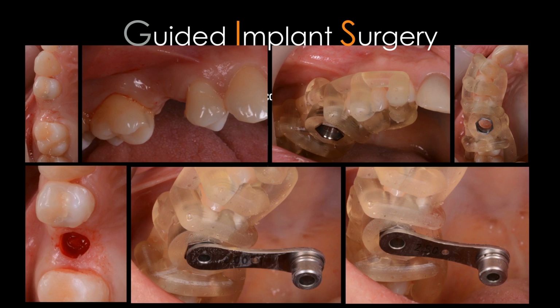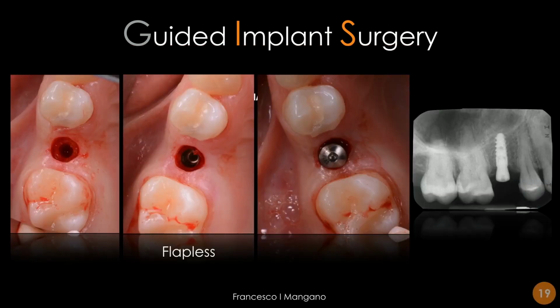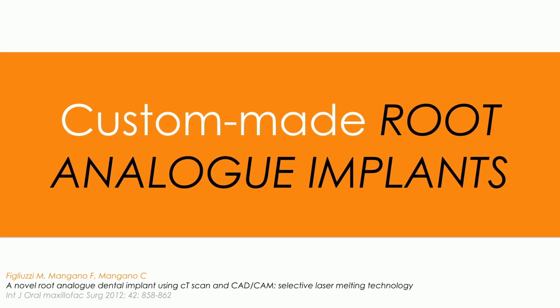We have published with Uli Oship this interesting report on our cases, very simple cases realized flapless, like one implant or single implant or multiple implants, through this system that is very reliable, and no issues at all during the surgery. So it's a very helpful way to use DICOM file from cone-beam computed tomography. But it's not the only way, because cone-beam computed tomography, as I told you, is the door to segmentation of DICOM file, and it's the door to computer-assisted design, computer-assisted manufacturing application.